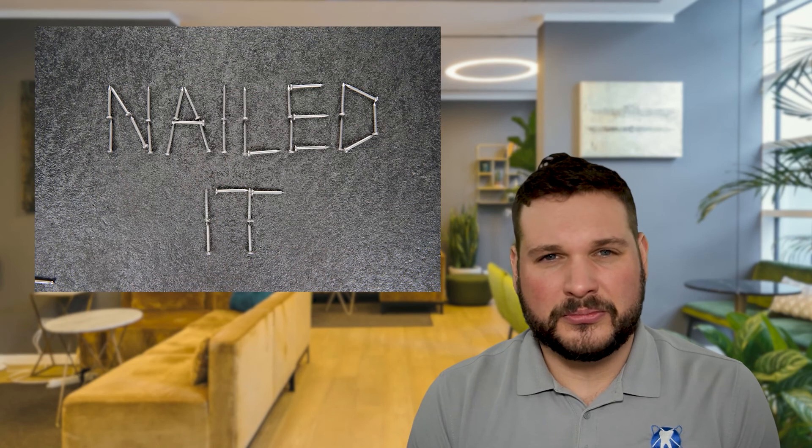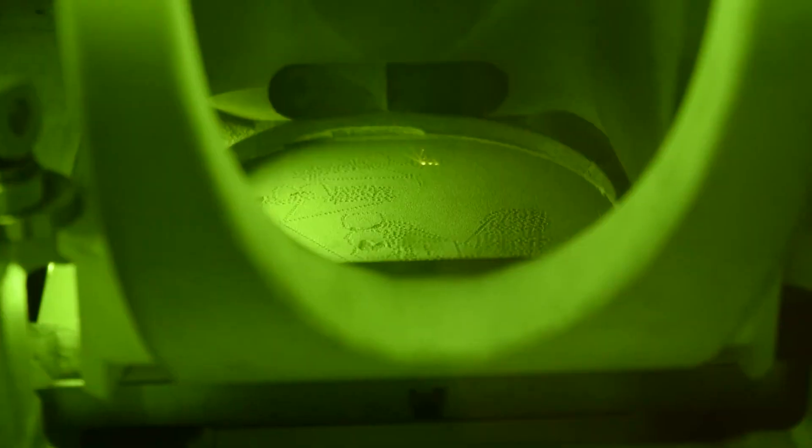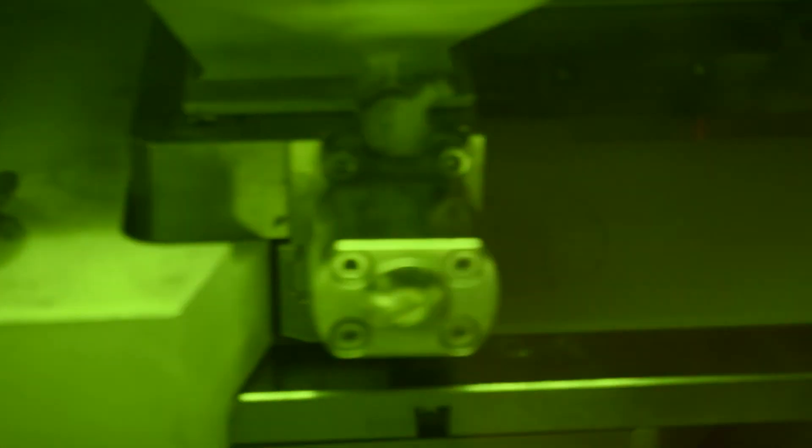The strength and accuracy of the DMLS process simply cannot be matched by metal casting. Assuming an accurate model is made, the final prosthesis fits the model with next to no adjustment. In fact, remakes for fit have almost completely been eliminated. The additive process also guarantees a uniform application of material, which adds to the structural strength and reduces any need for grinding in post-production. Additionally, since the process is additive, any unused material can be collected and reused, eliminating waste. There's a reason that we moved the casting equipment to the curb — laser sintering is superior to casting in every conceivable way.